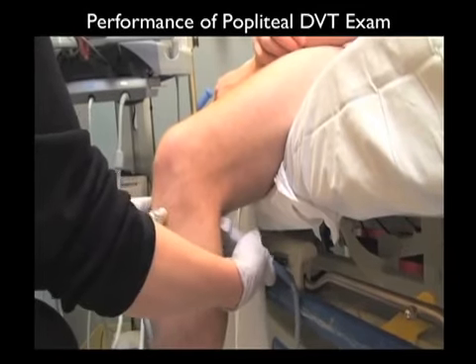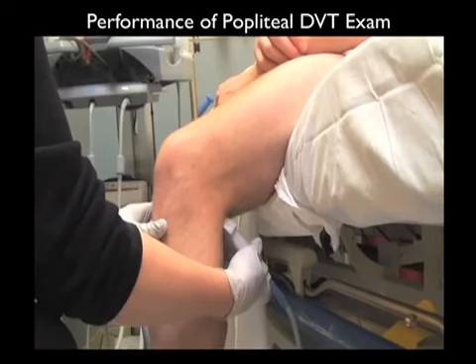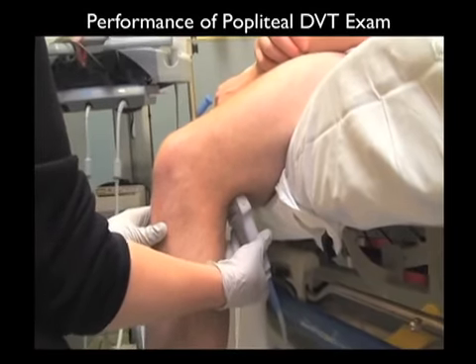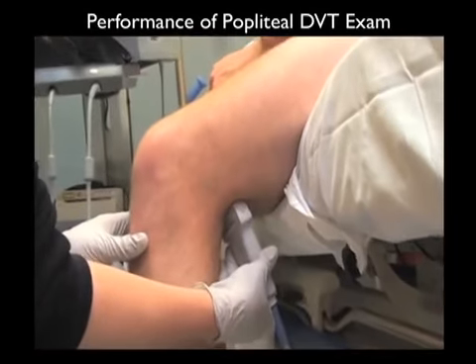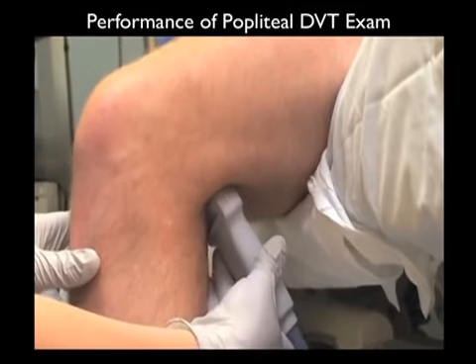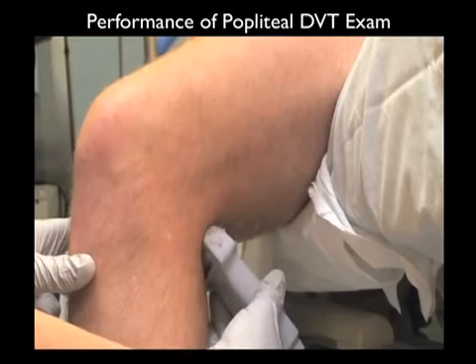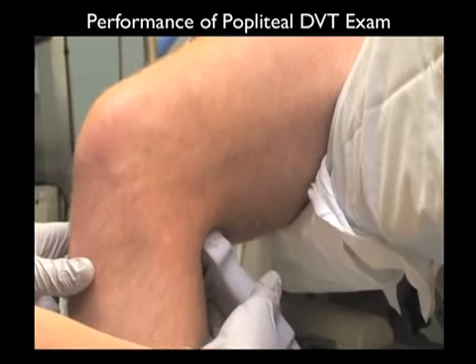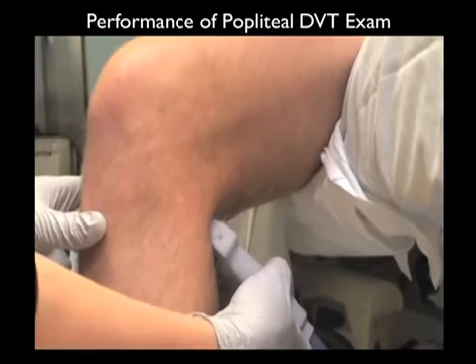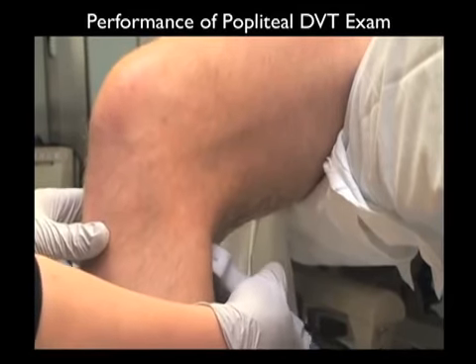We'll place the high-frequency linear array probe high within the popliteal fossa, sequentially compressing at levels down all the way down to trifurcation. Notice that we're using our other hand to stabilize the anterior knee as we press with the probe posteriorly. So again, we'll start high within that popliteal fossa, compressing sequentially all the way through the levels of the popliteal artery and vein, down inferior there, all the way down to trifurcation.